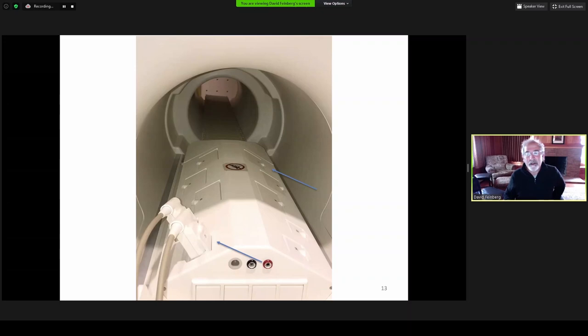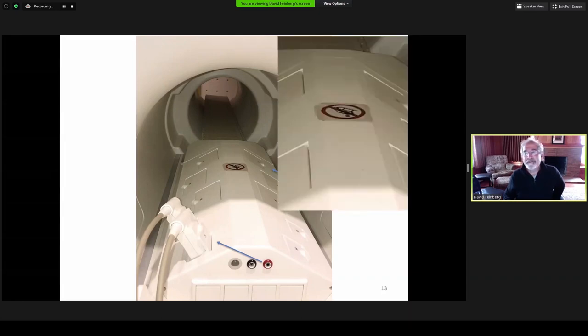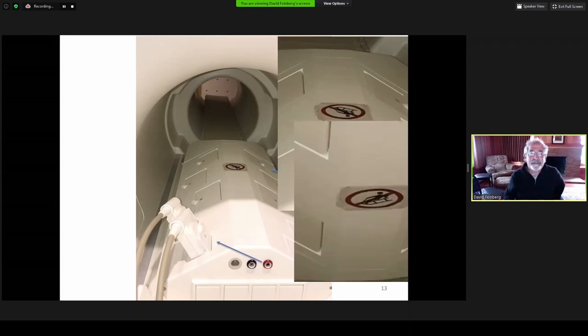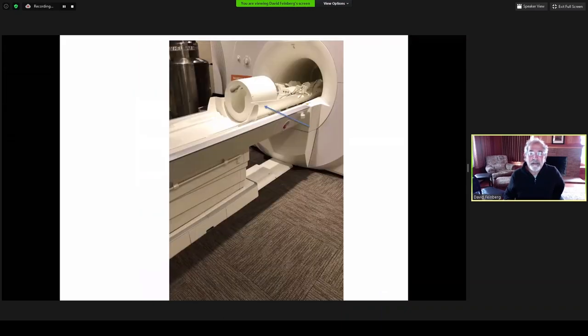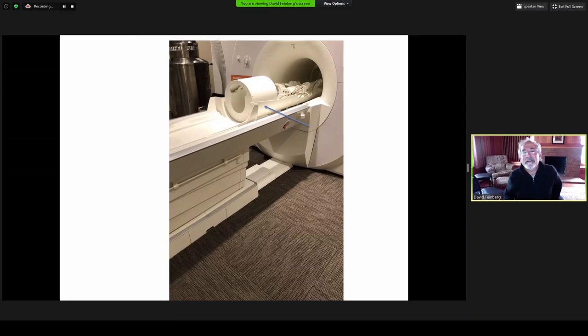You see the connectors. This is the coil connector box connected to the energy chain cables going out the back. The table has an extender which allows the head receiver coil to go into the gradient coil, and all the cable connectors are in the back.